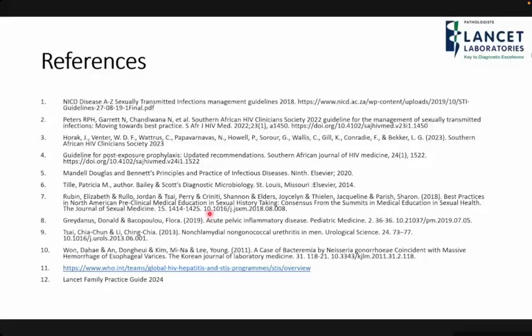And also, allied to that, the swabs, because it would appear that if we're going to ask for culture, we need to send a swab which is suitable for culture. But for PCR, it's actually a different swab, a dry swab. Different swab, yeah. So maybe you can just talk us through that.